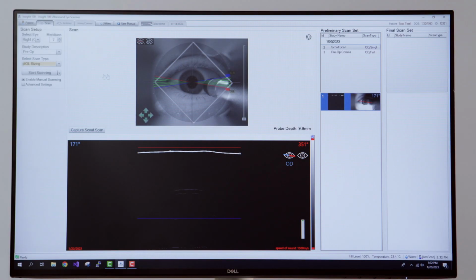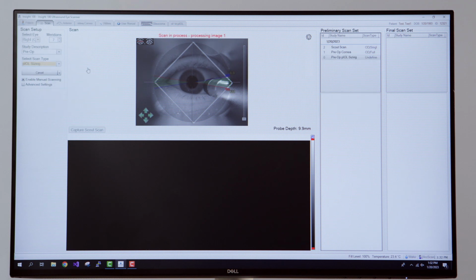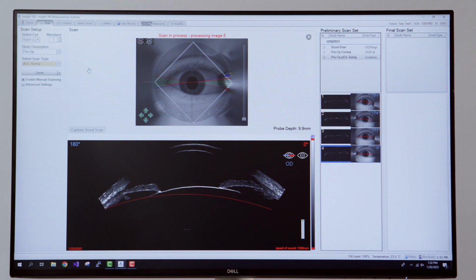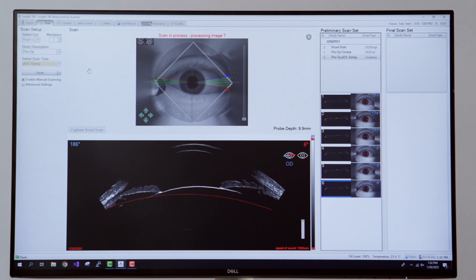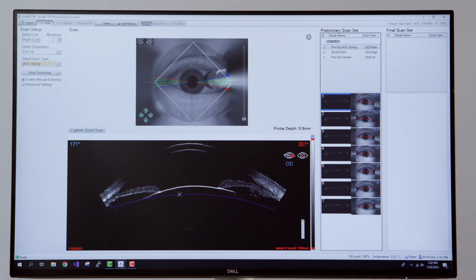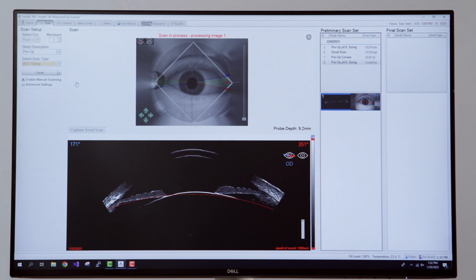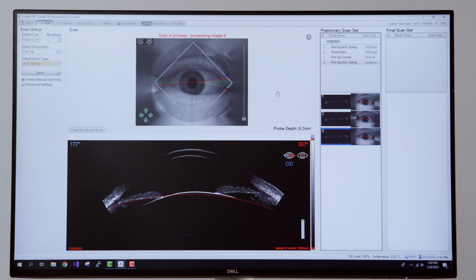Double-check the crosshair pupil centration and click Start Scanning. Each meridian image loads. The red focal line indicates where the focal plane was for this scan. Right from here, the focal line can be adjusted again if needed. Check the crosshair pupil centration. Click Start Scanning. Any single meridian can be rescanned if needed by right-clicking on the thumbnail image and clicking Rescan.